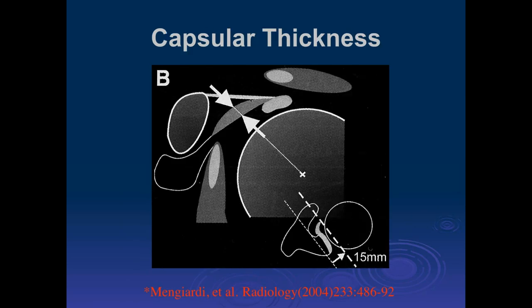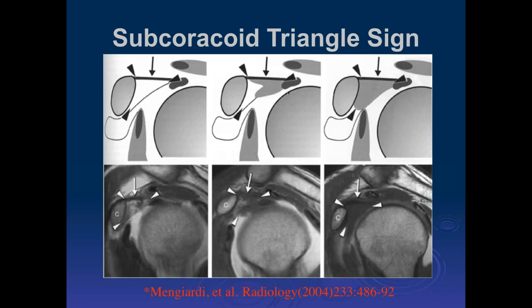And then when you start getting some chronic capsulitis, you can get thickening of the capsule in this location, which obscures portions of the fat within the interval. And then you can stage this by showing increased loss of the normal fat. This is just a little effacement.